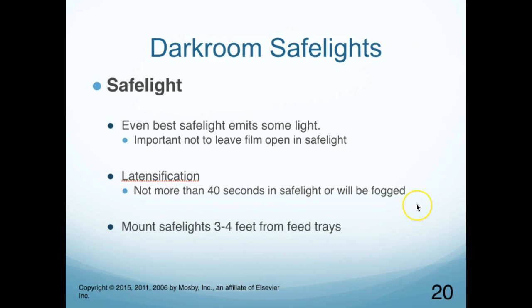So even the best safe lights emit some light, so it's important not to leave the films open in the safe light. Latensification, again, not more than 40 seconds in the safe light. Remember we talked about latensification? I have an idea, it'll probably be on a quiz or a test. And it's talking about how that's kind of made those silver elements in the film more sensitive.